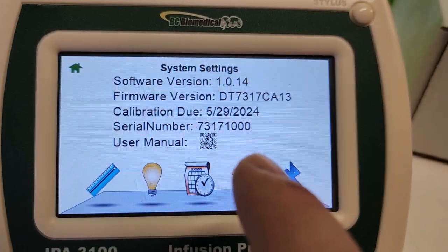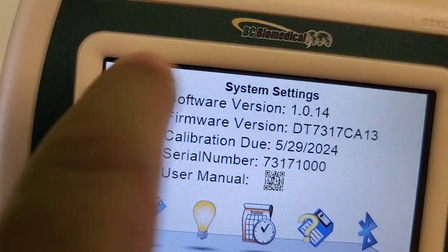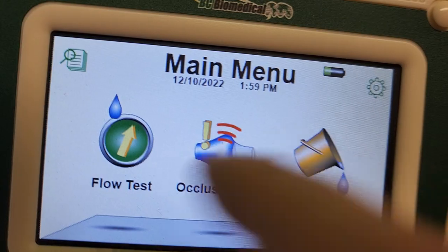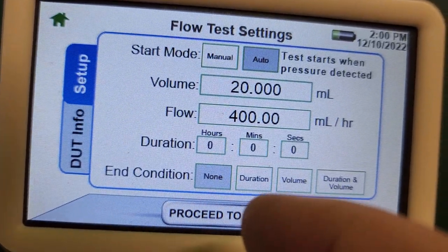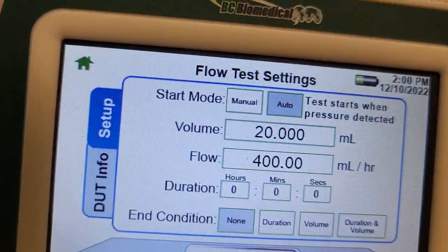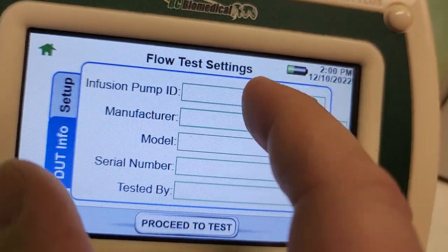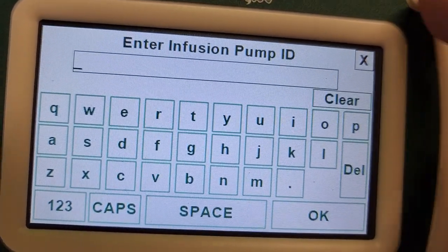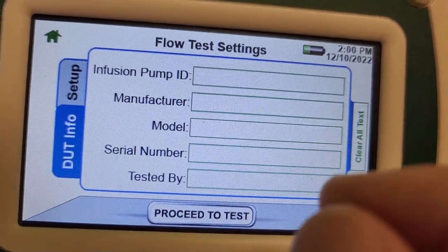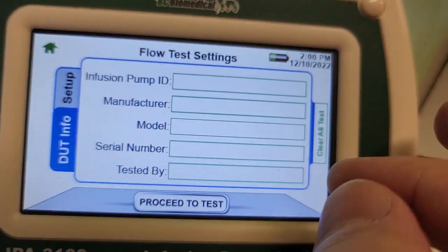Right here on the screen we have the user manual as a QR code. I really love that this company's been doing that - with QR codes I can always access the manual without looking for it. The screen is very easy to touch. We've got flow test, duration, and condition. And device under test info is probably where I can put in the specifics - yes, here's the keyboard when I type in an entry.